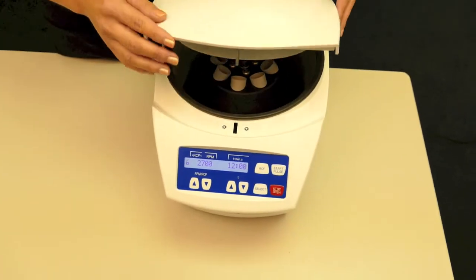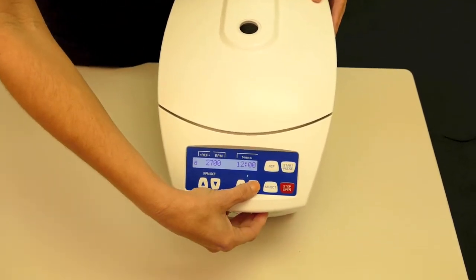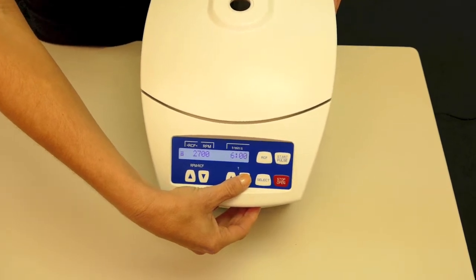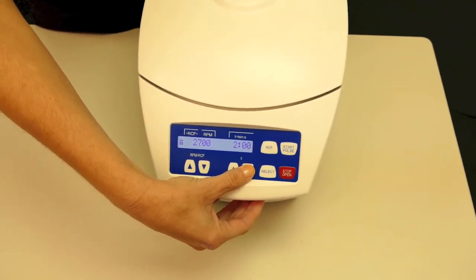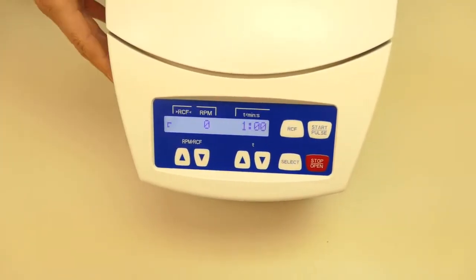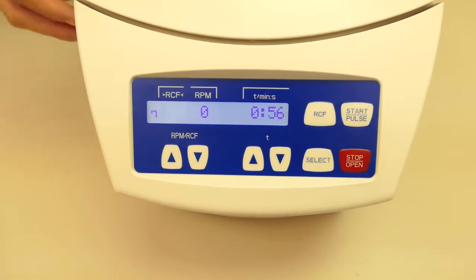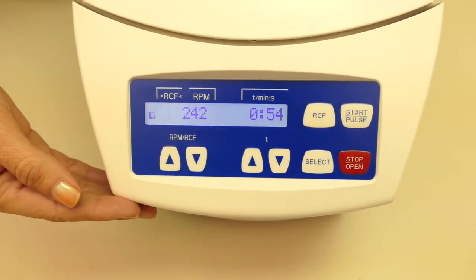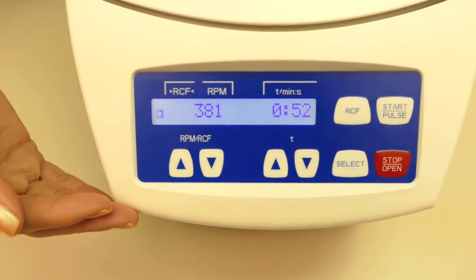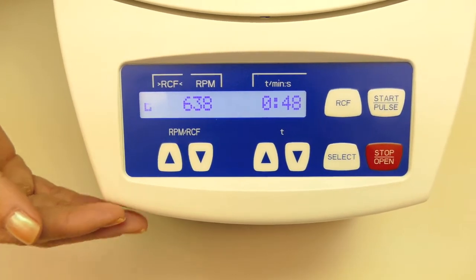Next, we're going to do a test run on the machine. We will close the lid and take your time down to one minute. Press start. This is just to see that everything is running properly. You'll note that the time and RPMs will increase and decrease on the panel.